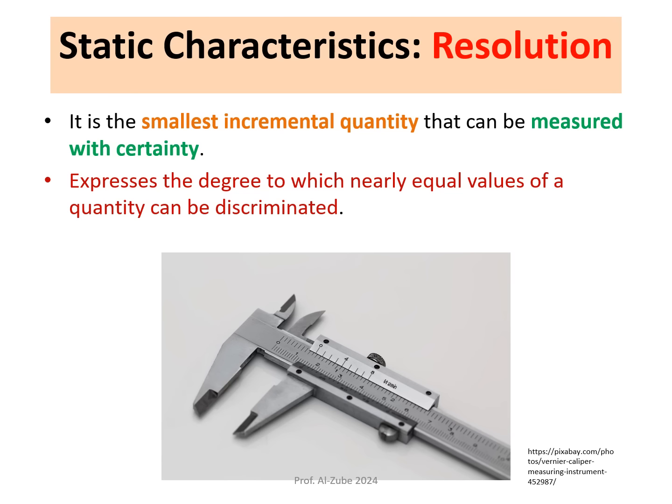Also, there's another static characteristic called resolution, and it is the smallest increment of a quantity that can be measured with certainty, expressed as the degree to which nearly equal values of a quantity can be discriminated. If you look here at the resolution, the smallest, tiniest measure that you can distinguish with your naked eye, that is going to be your resolution. That's how you look at it.